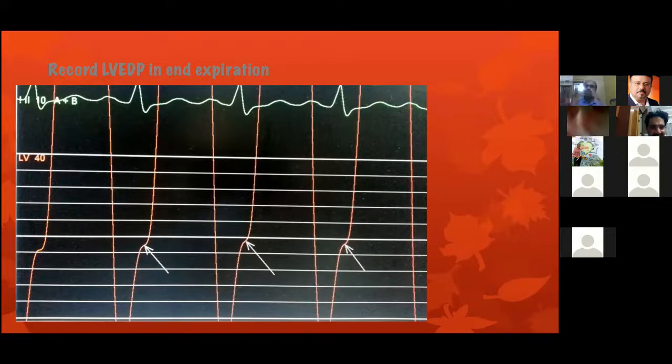The very basic reason is you are using a single transducer in a simple disease and trying to analyze the whole pathology. Since these pressures are operating at a much lower level, very often less importance is given to the right-sided hemodynamic events compared to the left-sided hemodynamic events.